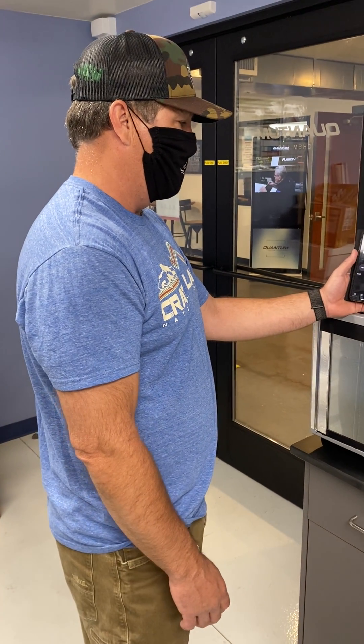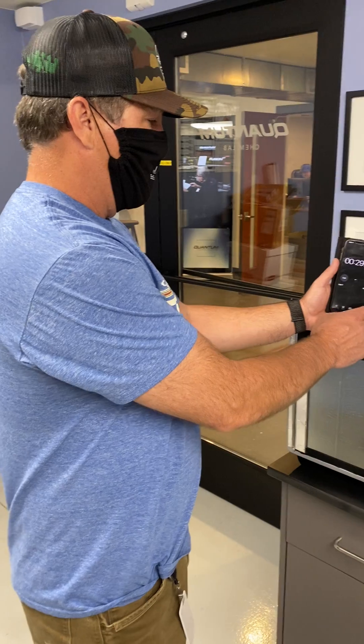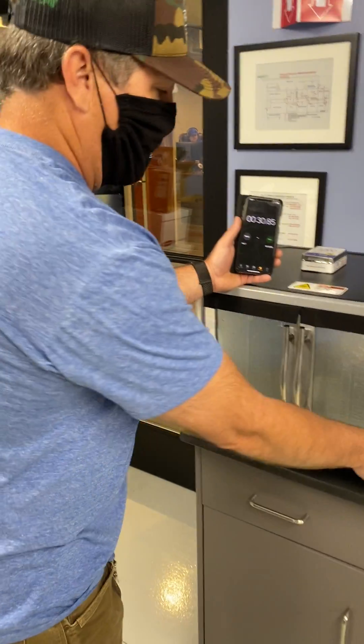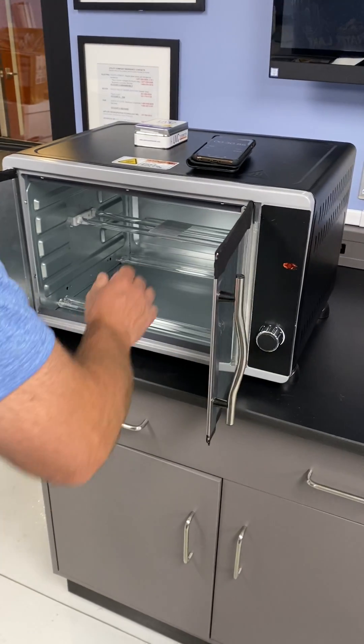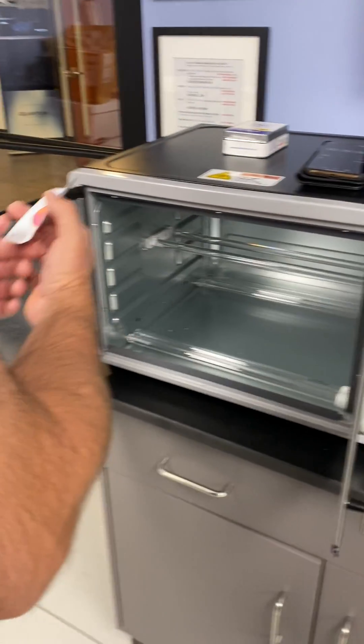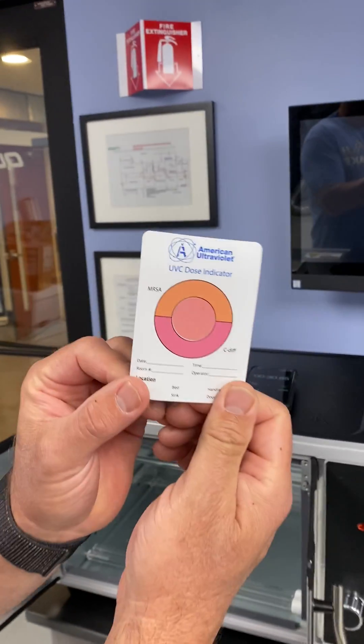We're at 25 seconds... 28, 29, 30. Turn off the box. Open this up. And what we should see is now the color is pink.